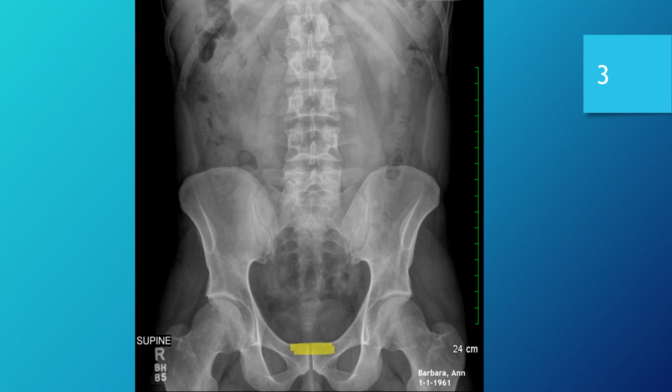As far as the superior aspect of the image, we have some of that bowel gas obscuring going on. And it makes it a bit difficult to identify for absolute certain where our kidney margins are. As best I can tell, there's a part of one there, and it looks like this is the margin for the right side.